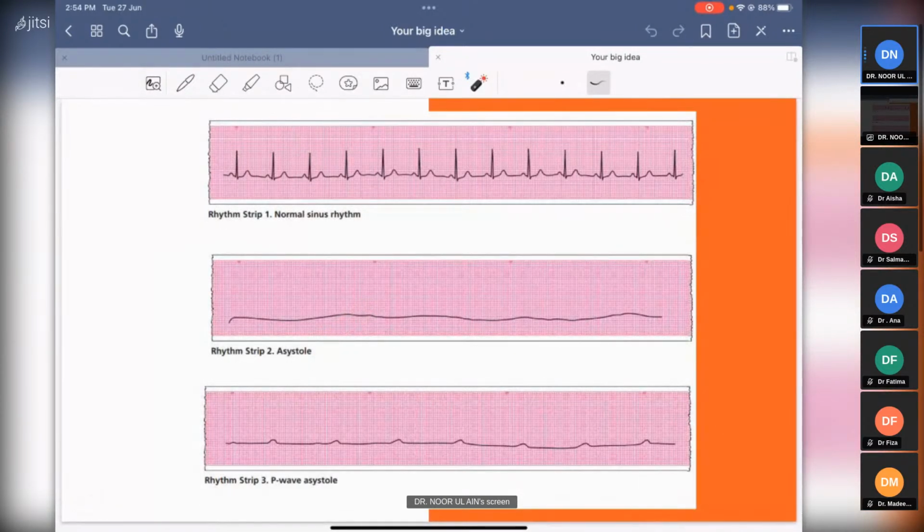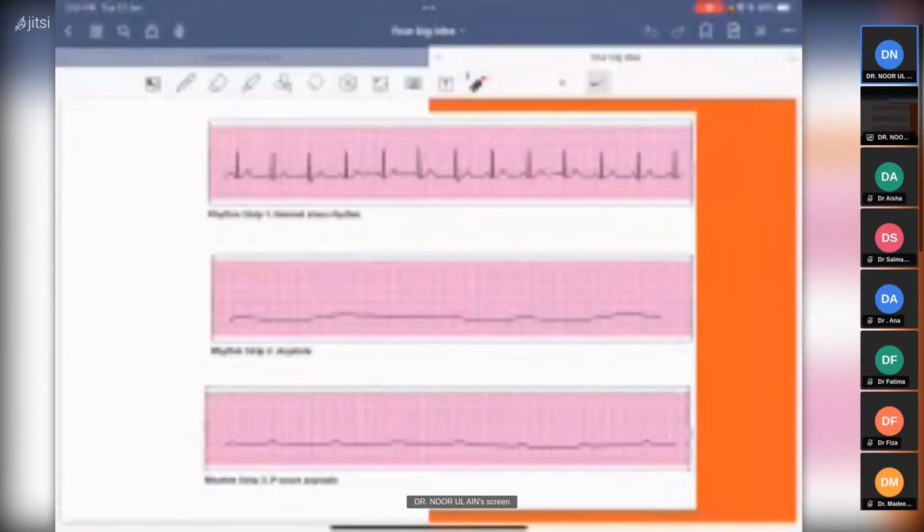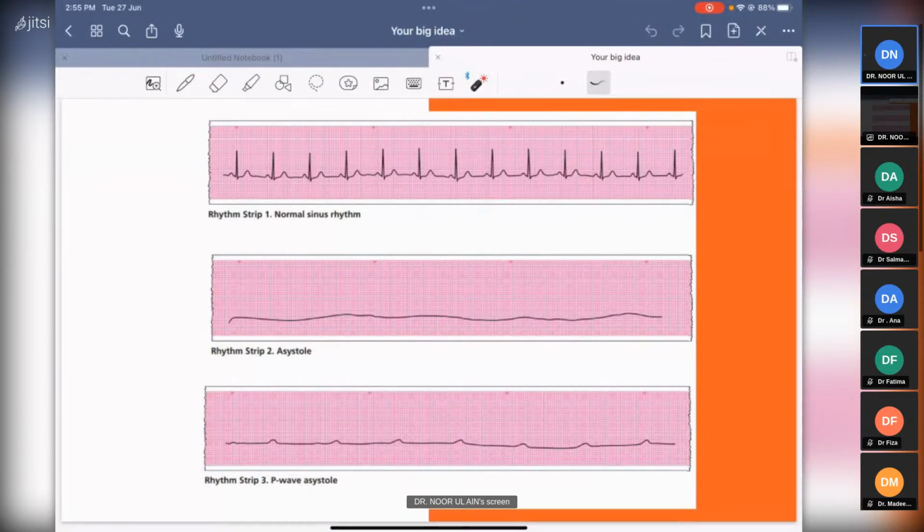And by the way, for pacing you need a pacemaker, you know what's a pacemaker, right? You know what's pacing. Pacing is when you put up a device and then you literally are helping the heart beat again. Okay? Externally. And for pacing, I'll show you the pacing spike ahead. You always need to start somewhere. You always need to have some sort of activity, otherwise the pacer doesn't work. How does pacing work? It has to identify, for example, a P wave, or a QRS complex. If there is nothing, the pacer won't run at all. So in asystole you can never pace it because you don't have any sort of activity to start the pacemaker. No rhythm is identified, so the pacemaker doesn't work.